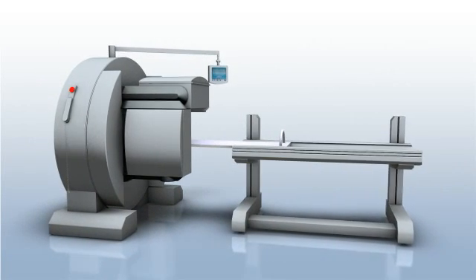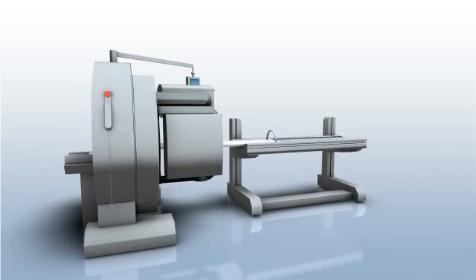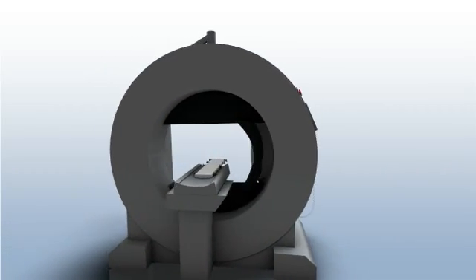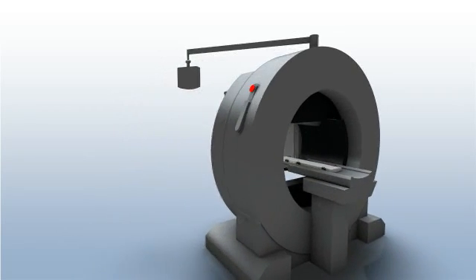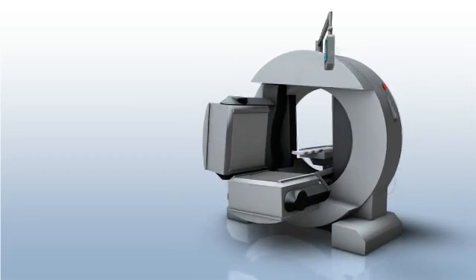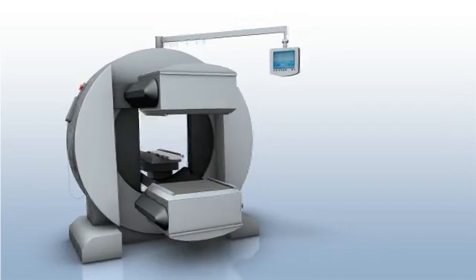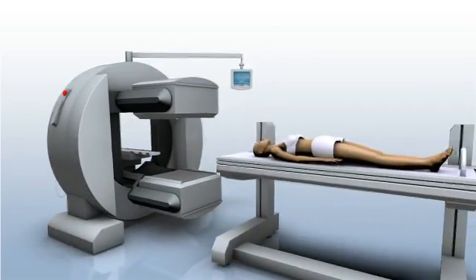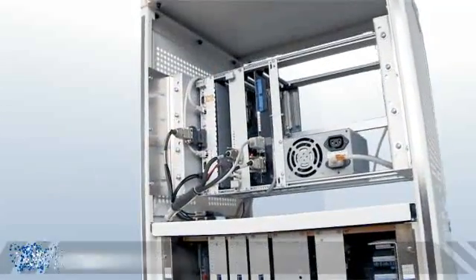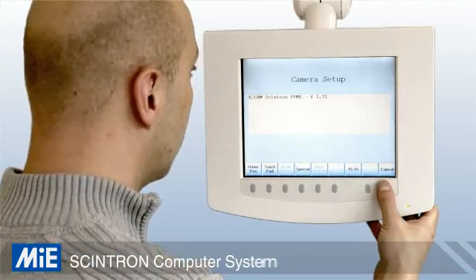The e.cam SCINTRON by MiE is a gamma camera system with superb resolution and uniformity properties, making it suitable for the entire spectrum of nuclear medicine diagnostics. The robust open gantry requires little space due to its compact design and allows for a high patient throughput. The SCINTRON computer is a powerful data and image processing system that guarantees effective work due to its optimized user interface.